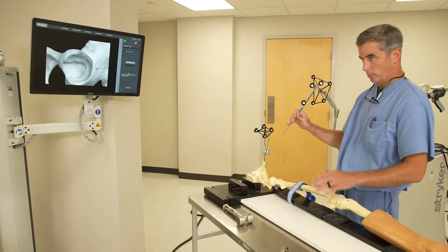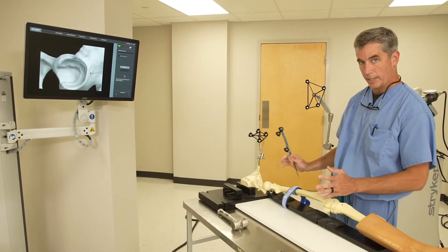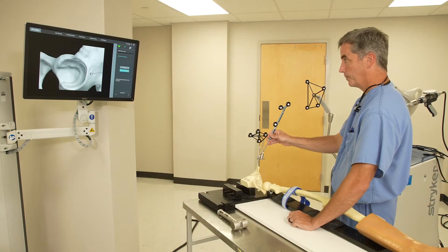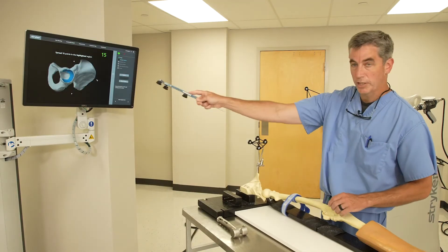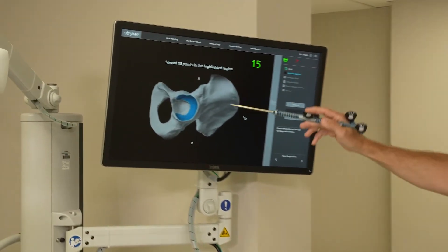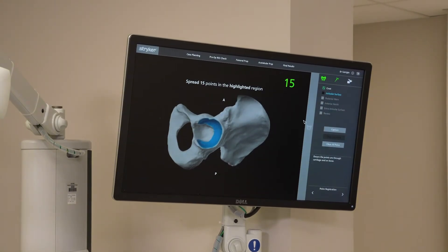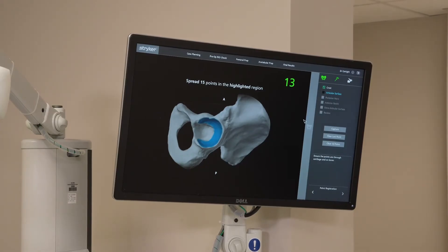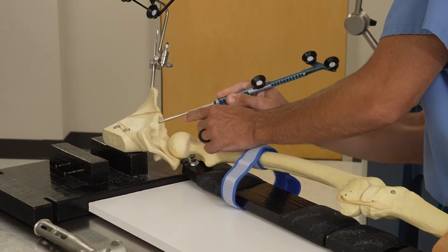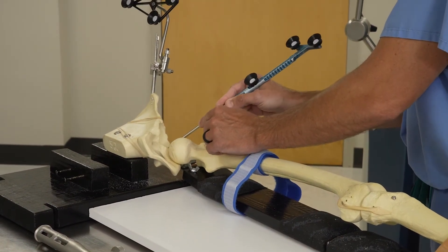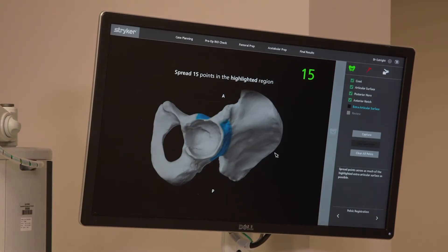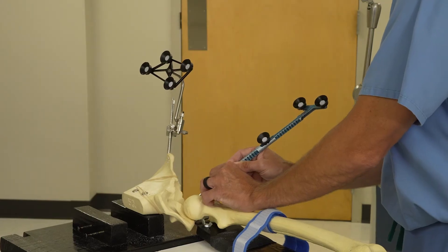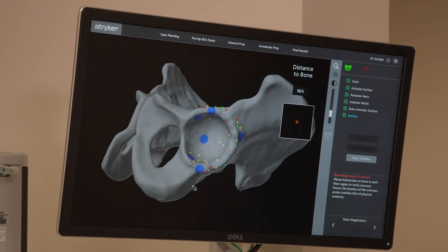Once we attach this array, the computer doesn't necessarily know where it is, so we have to tell it where it is. It's going to tell us what it wants us to do — it wants us to take 15 points in the area labeled blue, so I just start taking points. Now it wants me to capture them on the outside of the cup. Once I've done all those points, it gives me specific spots it wants me to touch to confirm that it knows where everything is.